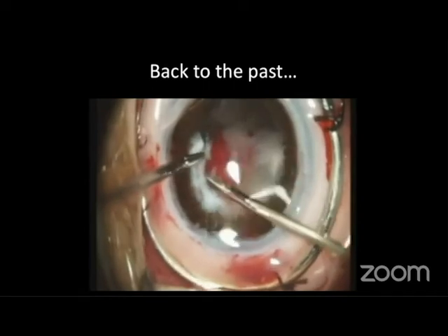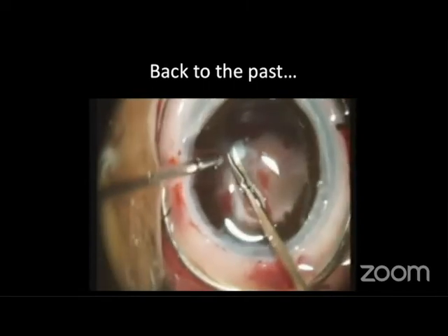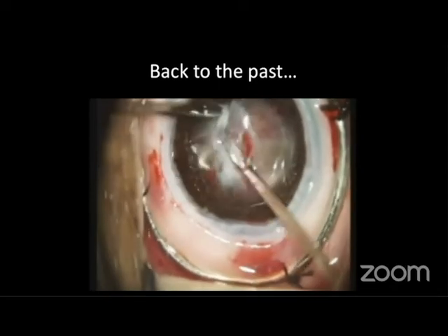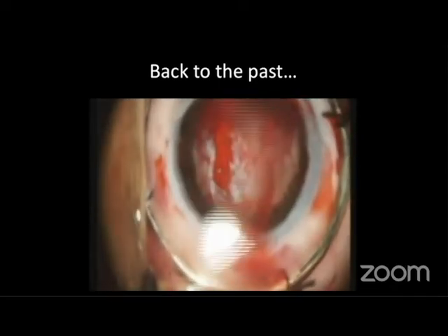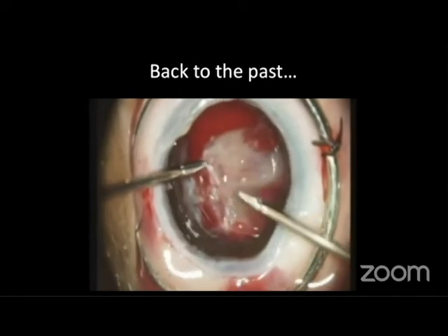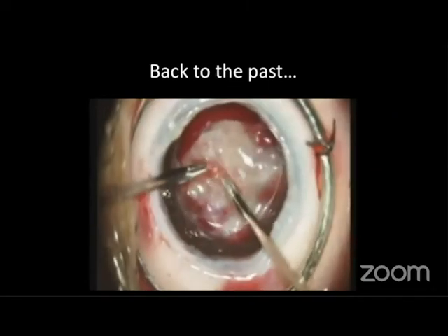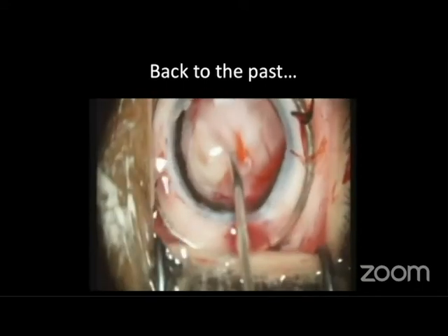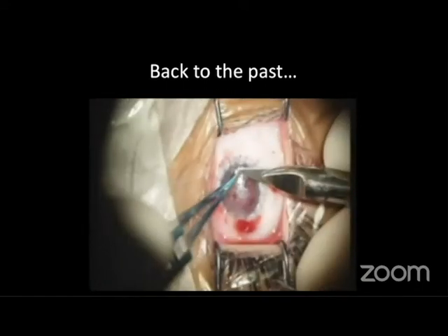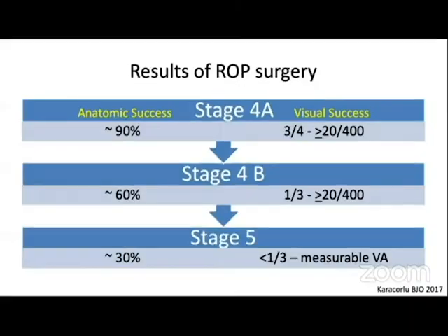So with the open dissection of the fibrous tissue with scissors and forceps through viscoelastic, and the parallax when we operate through the fluid does make this difficult. It's not as easy as it looks. So we managed to remove all the fibrous tissue, used viscoelastic and closed the eye.